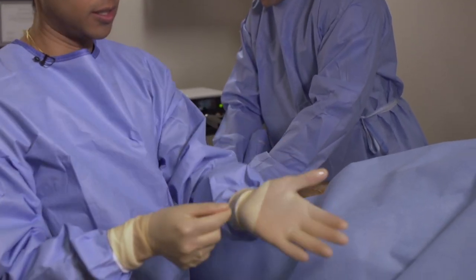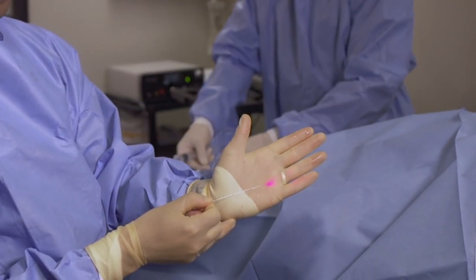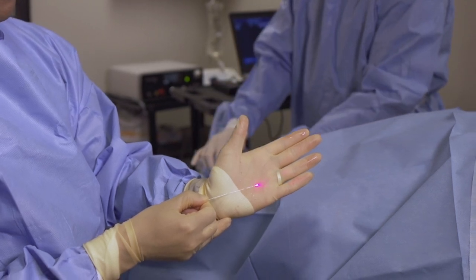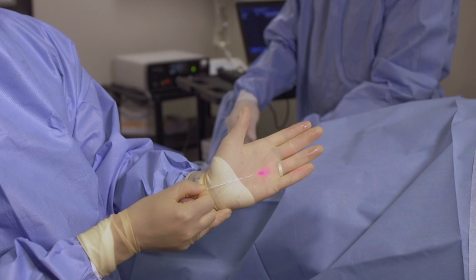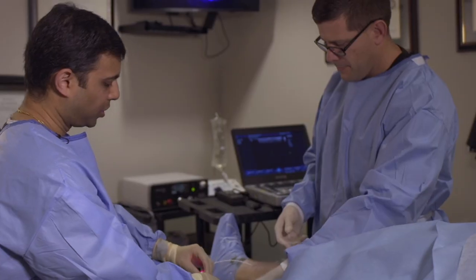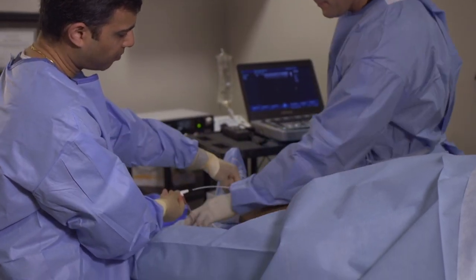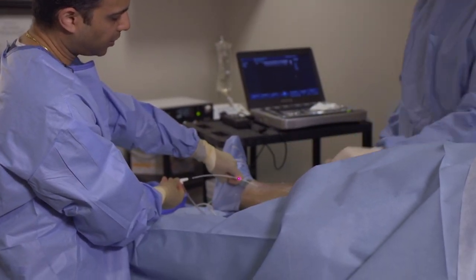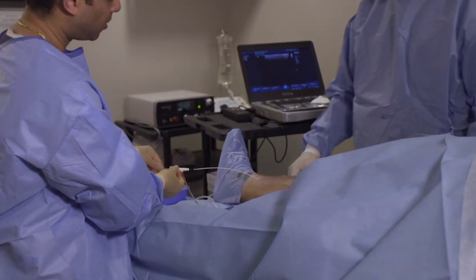Over here is the actual laser — the functional, working portion of the catheter. This is going to sit just outside the catheter, and once we activate the laser, it will go ahead and perform the ablation and closure of the actual vein. We're just going to thread the laser fiber. You can actually see the red light — the laser entering the catheter there — and that's going to go all the way in.